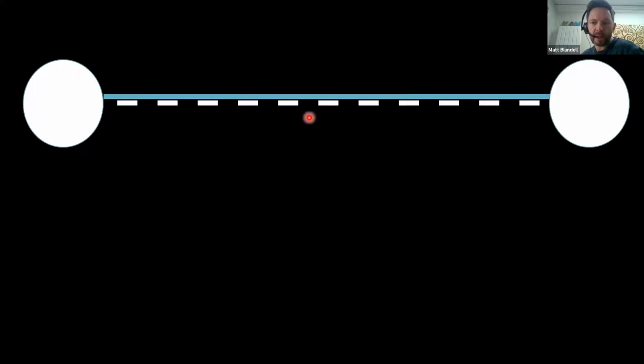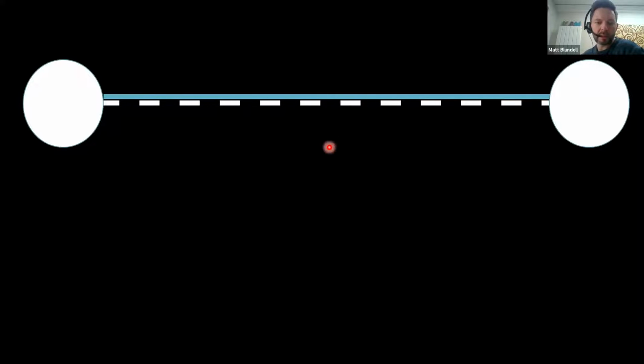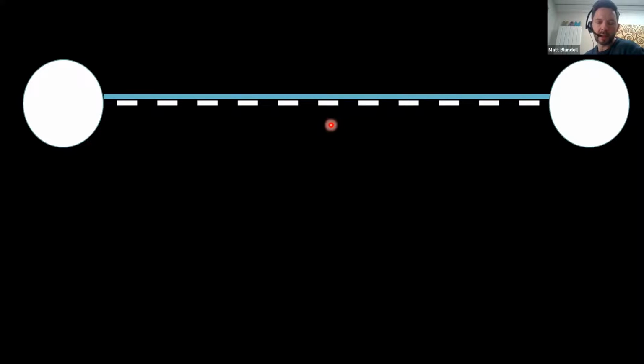So imagine this is a rib here, we've got a rib here. We've got the parietal pleura, which is adherent to the chest wall, and you've got your visceral pleura, which is on top of your lung. So normally, without a pneumothorax, as you breathe in and breathe out, that visceral pleura is moving backwards and forwards. And that's what you see as lung sliding. So the ultrasound can come down, go through or bounce off the parietal and visceral pleura, and it bounces back and it sees this lung sliding.